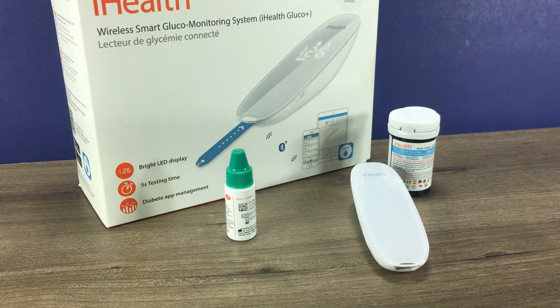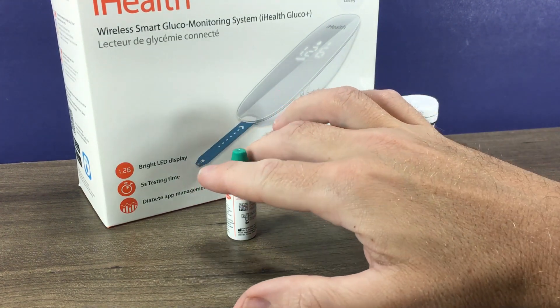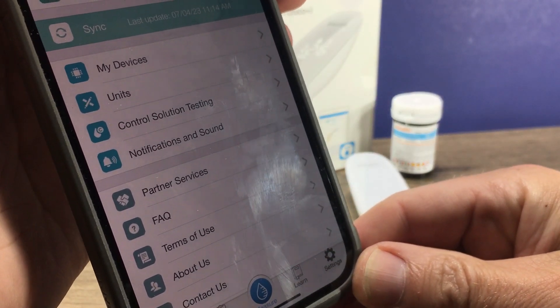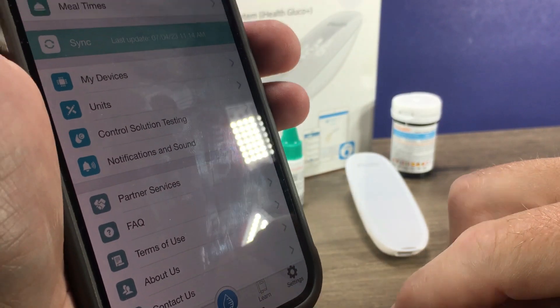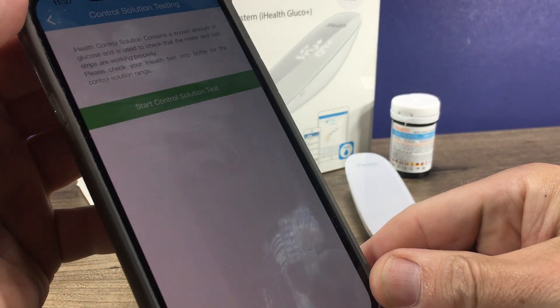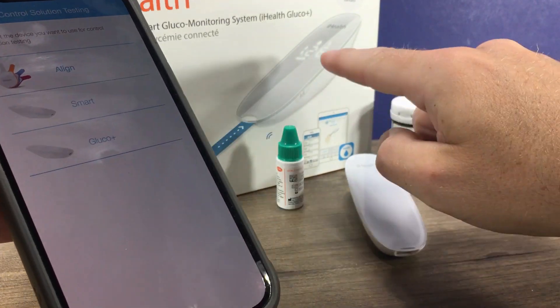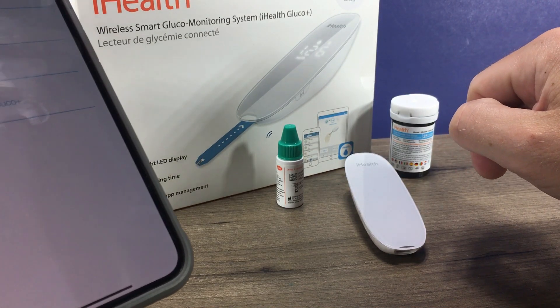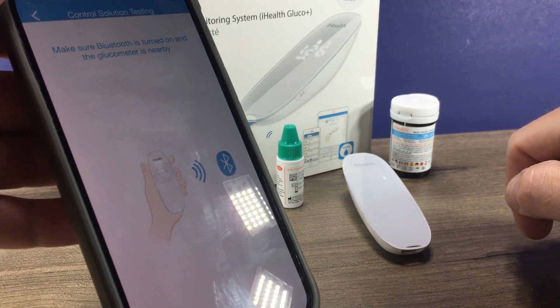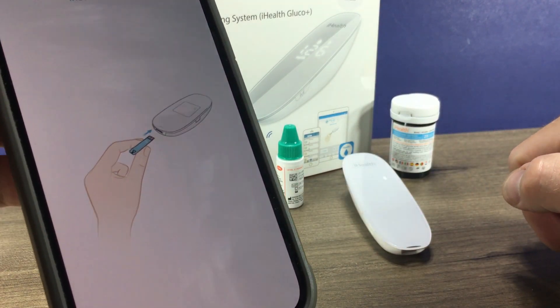Okay, so let's run a control solution test. To do that, you'll need your test strips, your meter, your control solution, and then you'll want to open your app. In the app, under the settings menu, you will choose control solution testing, and then you hit start control solution testing. You pick your meter that you're using. It's going to wake up the meter and then prompt you to insert the test strip.